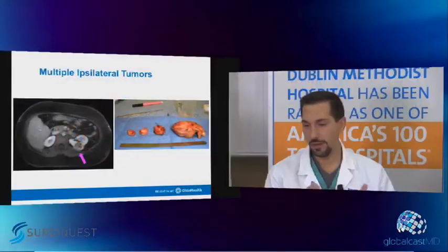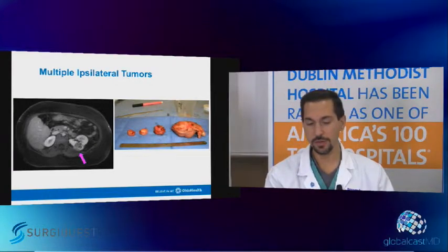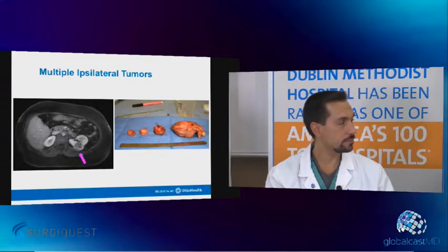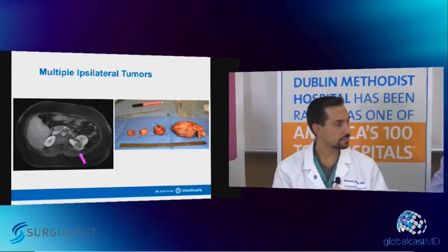Would you have done selective control on that one? In his case, because he had normal renal function preoperatively and it's kind of an elective partial, I didn't. We did complete ischemia because when you do a heminephrectomy, you've got some big vessels in there, and you're going to have multiple segmental arteries contributing to that defect. So my priority in those cases is just to have an ischemic field. I found in those polar nephrectomies, we have been able to do selective clamping. You can usually, in many cases, find the lower pole branches that are feeding, but the problem becomes the posterior renal artery, because the posterior renal artery tends to be the whole back side of the kidney, and so when you do that hemi, that becomes a problem. But we've gotten lucky in a couple cases where we were able to do those selectively. And I don't know if it makes any difference or not, but a 14-minute warm ischemia time probably is not much different. Yep.